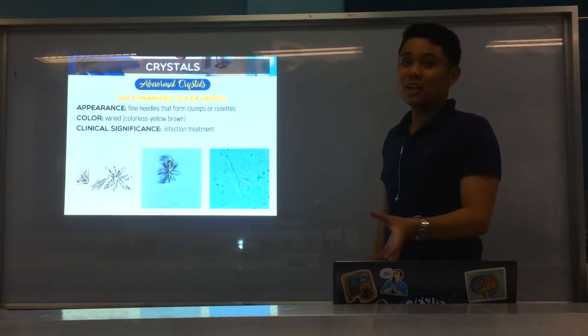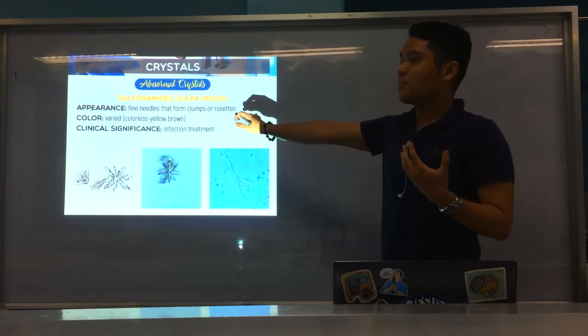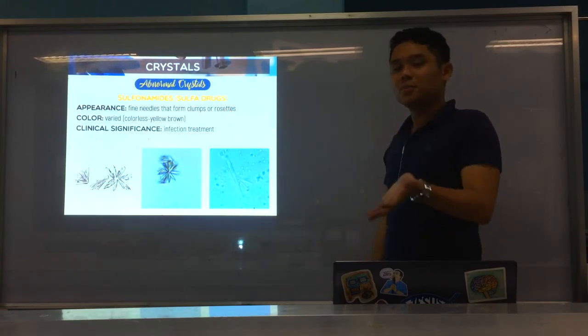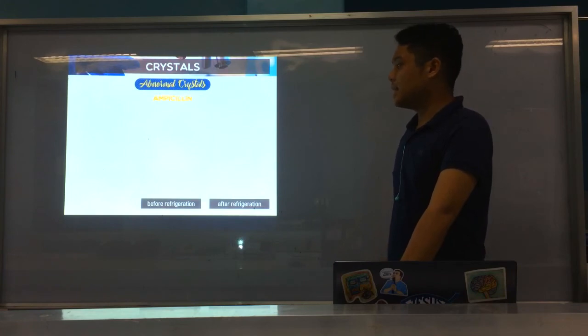Always look at, example, if hatagan mo case study, always look at the situation of the patient, unsay presentation niya. Like history, example, drug intake history. So ni-mention na sulfonamides, o possible na ang crystals na nakita na clumps or rosettes, that could be sulfonamides. Okay? All right. Next, you have ampicillin.